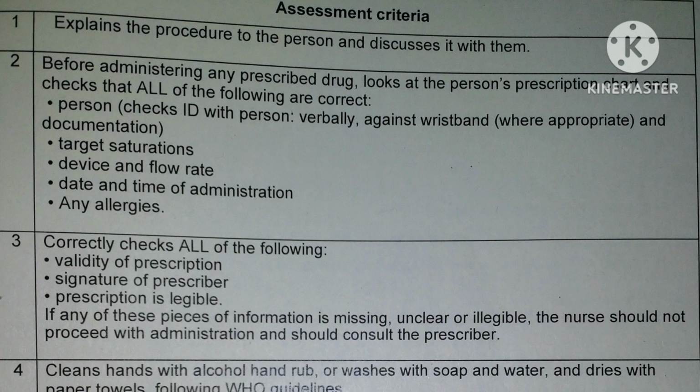First we have to gel our hands using the 6 steps of hand hygiene and check the scene for safety issues. We can tell them, "I am checking the area for safety and it's safe to approach." Then we have to introduce ourselves. Hello, my name is so and so. I am your nurse today and I am here to help administer oxygen therapy to you.